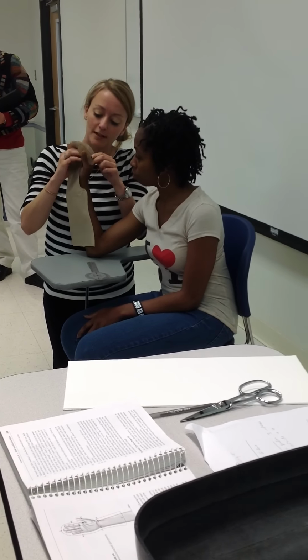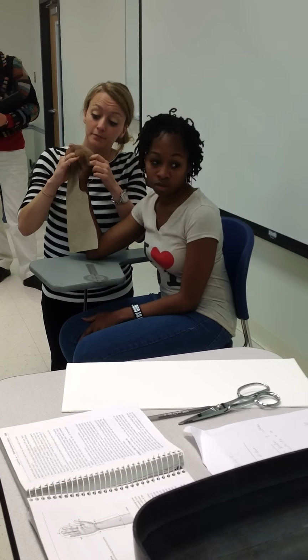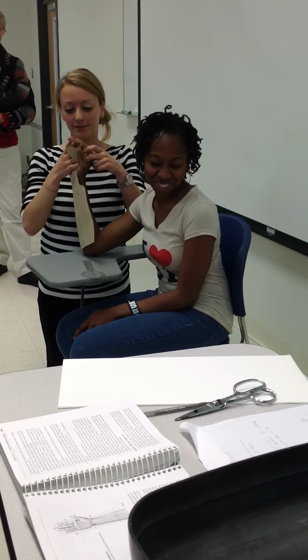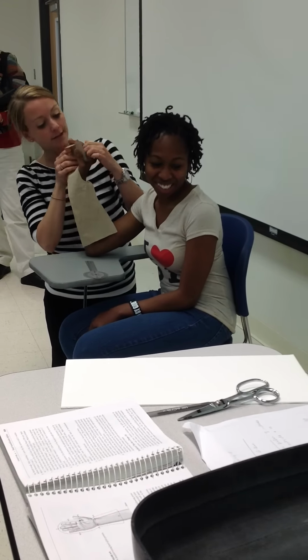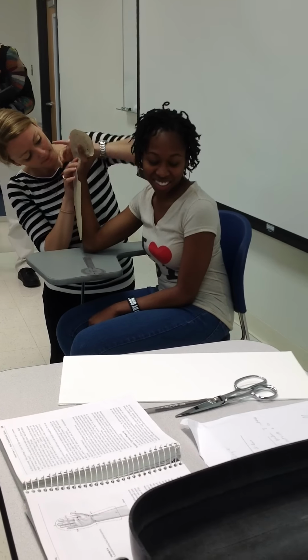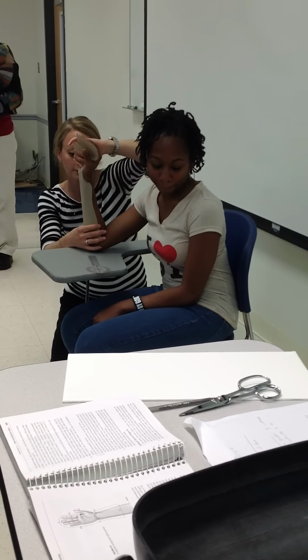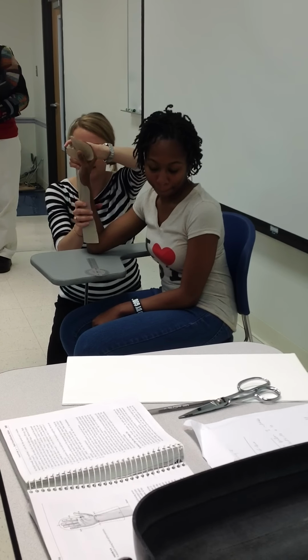And a lot of times if you just have your patient look away, because they're going to try to think that they're helping you, and they're really not. Okay. So that's a pretty good pattern. Probably going to be a little bit long. And I can always trim up the sides a little bit.